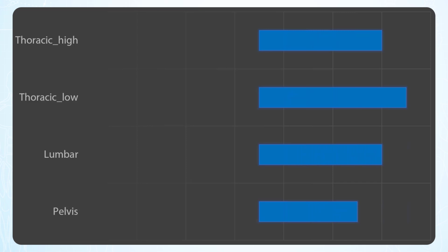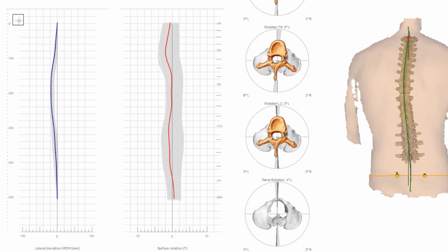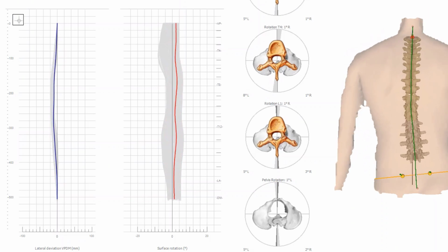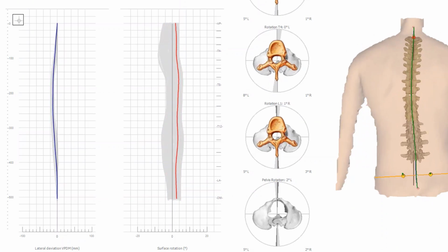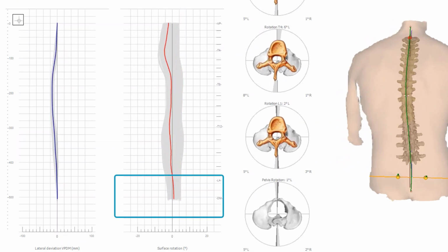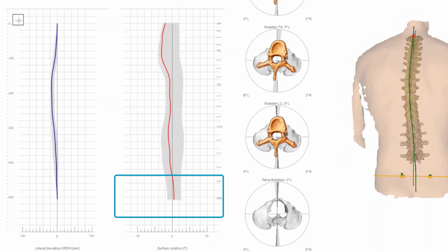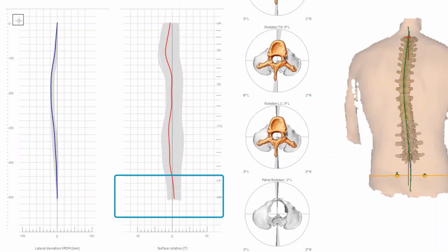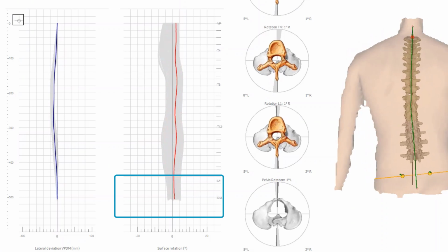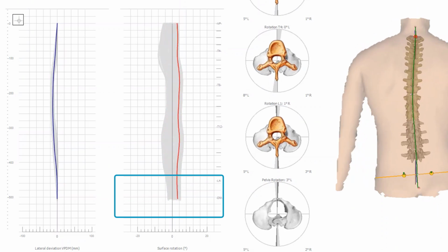In each case, the pelvis forms the clocking block that initiates the visible rotation. Maximum pelvic rotation is normally observable at the end of the ipsilateral terminal stance. Caution: there's a small stumbling trap here. The lowest end of the surface rotation graph reflects the supposed pelvic rotation. In order to keep the graph consistent, the pelvic rotation is observed here, in contrast to the real pelvic rotation, from the back. So in the surface rotation, we are looking at the rotation of the DLDR line, which roughly corresponds with the transverse alignment of the PSIS.